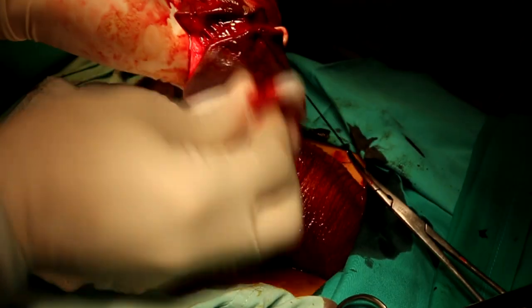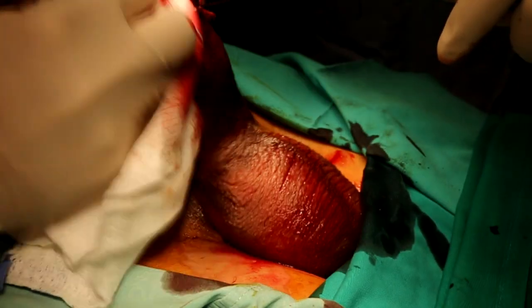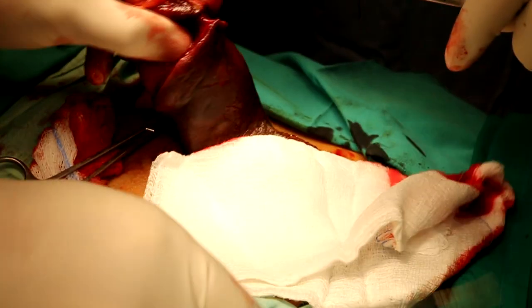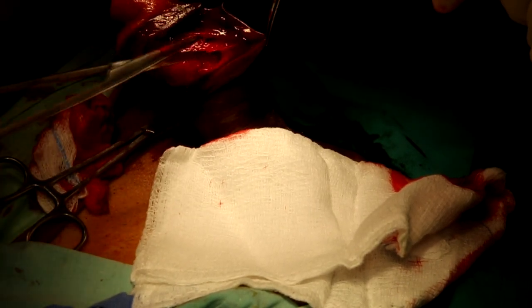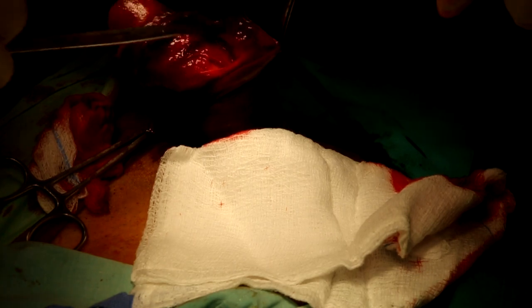Once you reach this plane, the degloving will be easier. See the scissor again. So yes, traction and counter traction make the degloving easier. So traction, and see, introduce the scissor closed and then open, and then cut the fascia in between. By this way, immediately on the surface of the tunica.